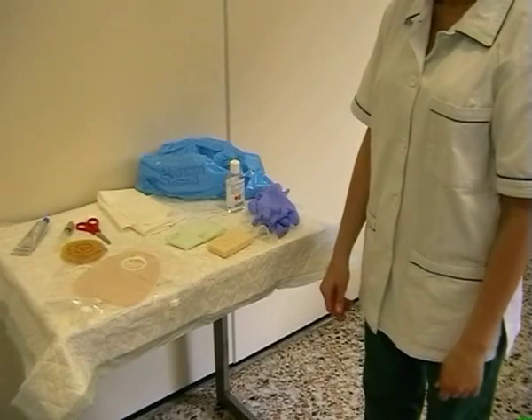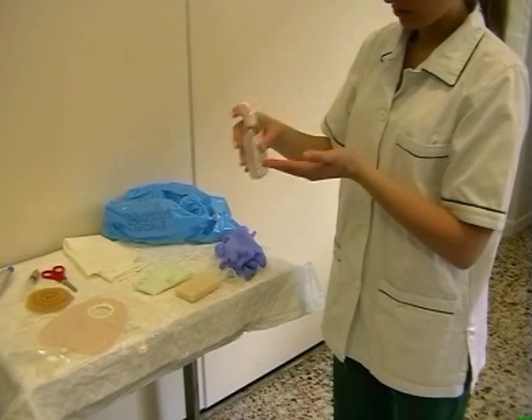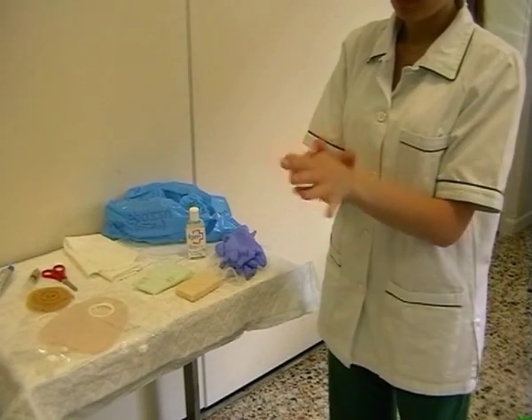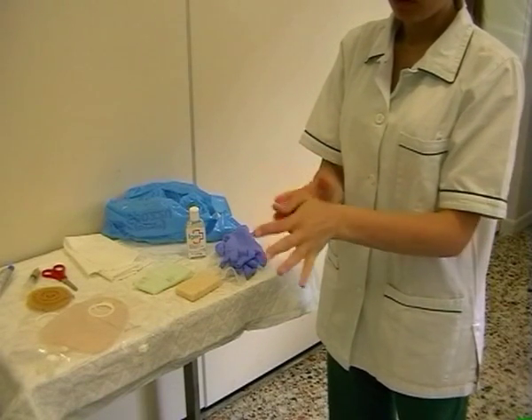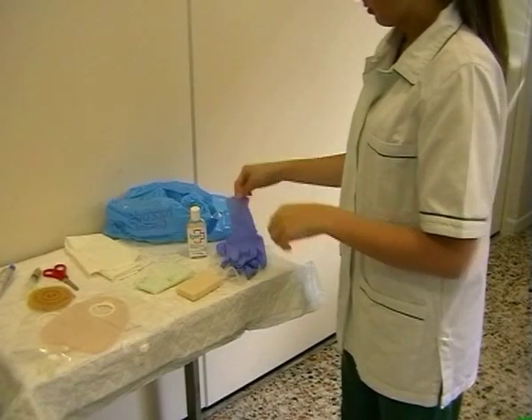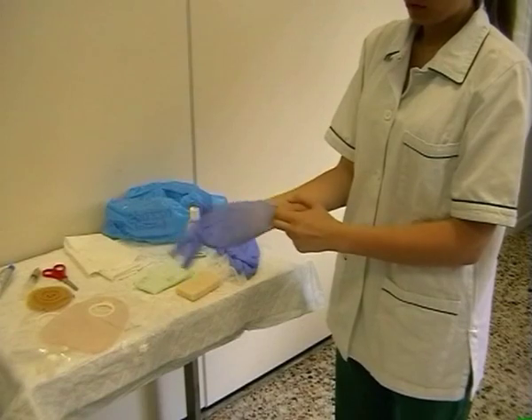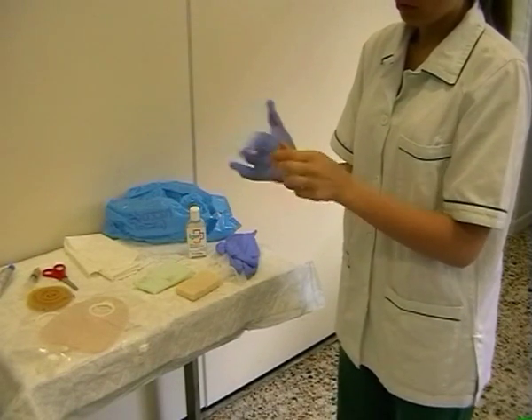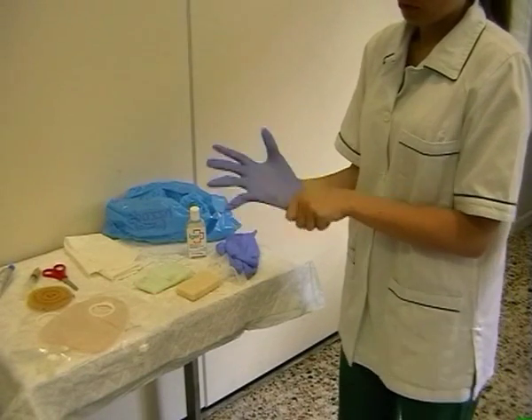Tecniche riviste nello specifico. È importante, prima di procedere alla cura e gestione dell'urostomia, lavarsi le mani. Il lavaggio delle mani può avvenire tramite clorexidina oppure con acqua corrente e sapone. L'infermiere indossa i guanti monouso, ma il paziente può non indossarli in quanto si tratta di una sua parte del corpo.